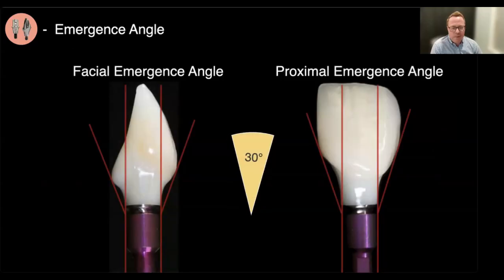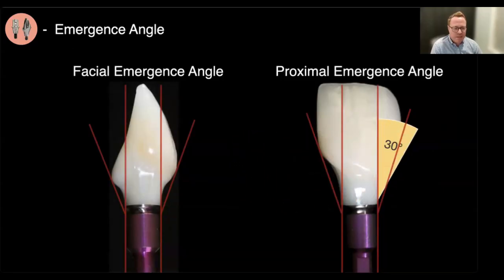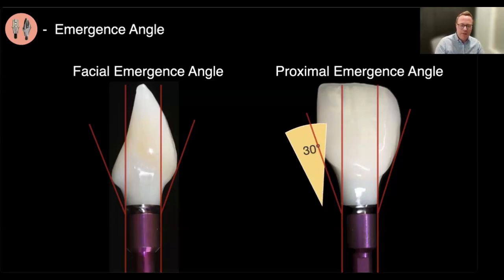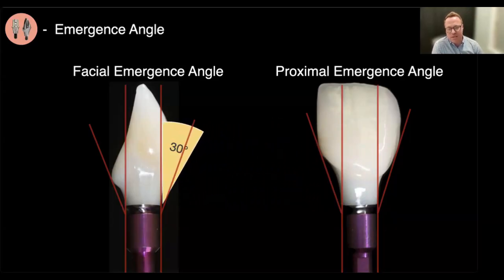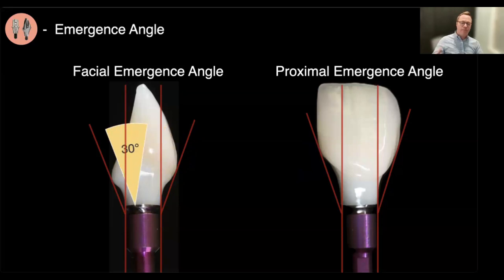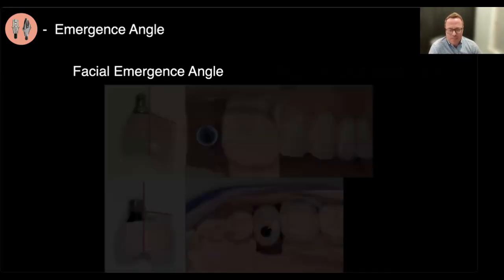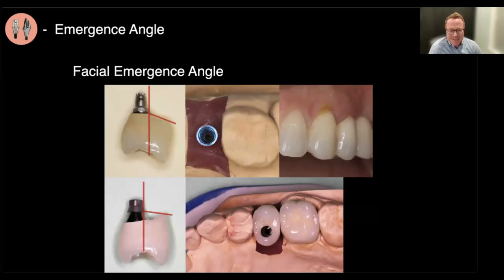And so we want to think about this in our crown designs, that we want to have everything be less than 30 degrees. And here you can see some examples where mesial distally we see this radiographically, but clinically we may not see facial lingually as well. And so we want to make sure that it conforms to that. And you can see many examples where it definitely doesn't do that and it violates that. And of course, that could be a problem for multiple reasons.